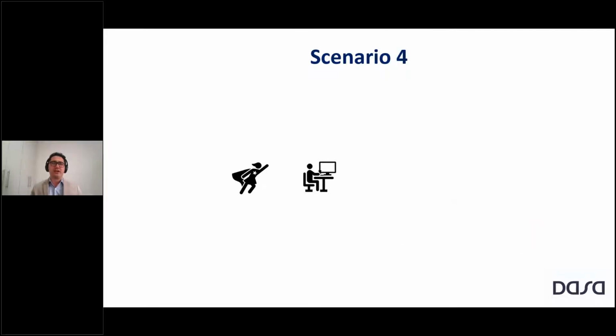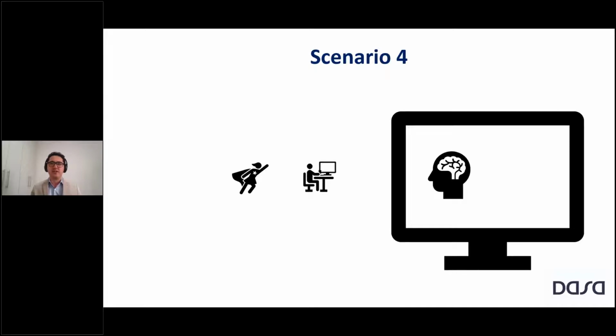Now, the fourth scenario, we arrive at work, sit at our workstation, we open our PACS, the result is integrated, and it's shown in a way that I can definitely understand in a clear manner. But then what? Let's say we have a model that tells me if that study specifically has a tumor or a hemorrhage or something else. Giving me that information doesn't exactly help me, because I still have to write the entire report and describe a lot of specific things about the disease that I found. So maybe that can reduce error by pointing out the major diagnosis in that study, but that's not that helpful, because I still have to write the entire report. It doesn't help me save time.